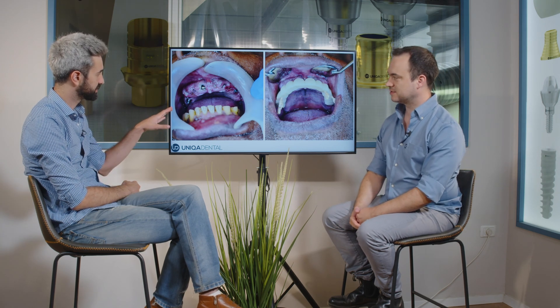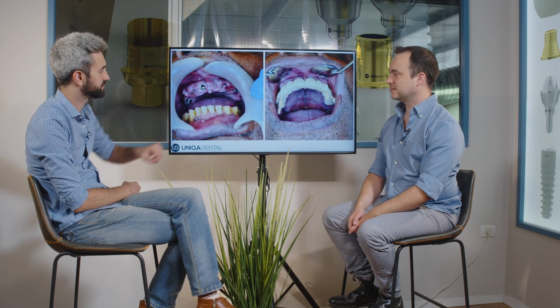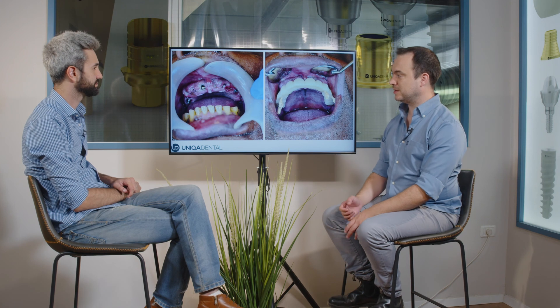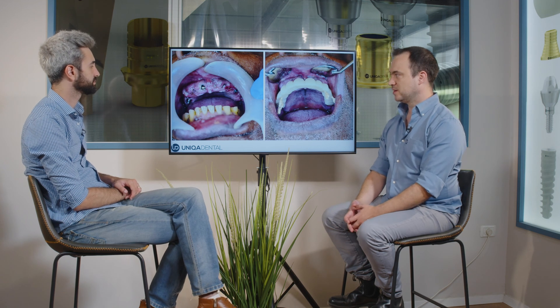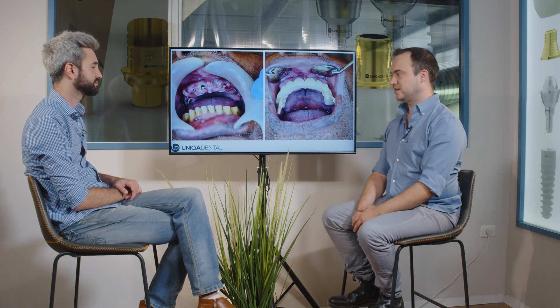This is after the healing process — it's before the extractions, because you can still see the teeth. You didn't have implants in this region even before, so it's not a problem. For the healing process of those two new implants, we placed back the old restoration. We fixed it a little bit, placed it back, and the patient went on with this restoration for another three months so those two implants could also integrate.